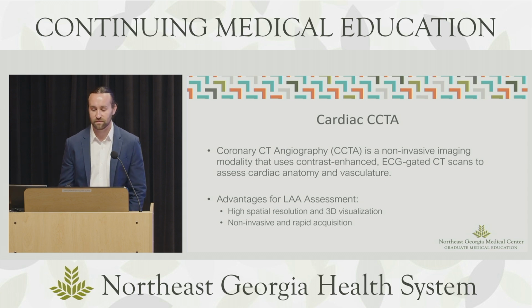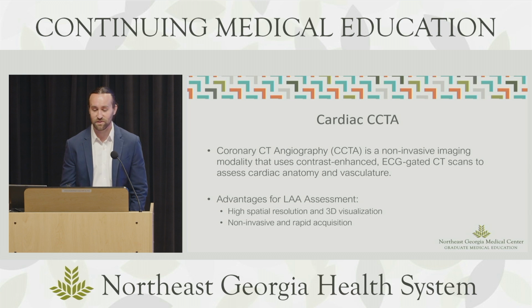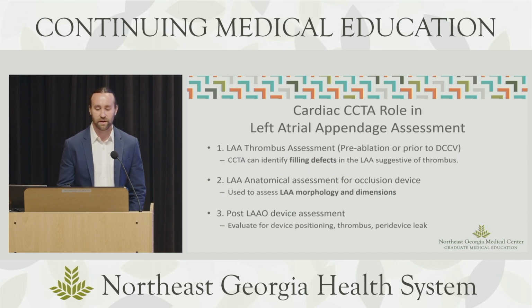Cardiac CT, for those that may not be familiar, is a non-invasive imaging modality that uses contrast-enhanced EKG gating to assess cardiac anatomy and vasculature. The advantages of cardiac CT for left atrial appendage assessment are that it has high spatial resolution and 3D visualization, and it's non-invasive, that's the key word, with a rapid acquisition approach. Cardiac CT predominantly has 3 specific roles in left atrial appendage assessment that we're going to talk about.